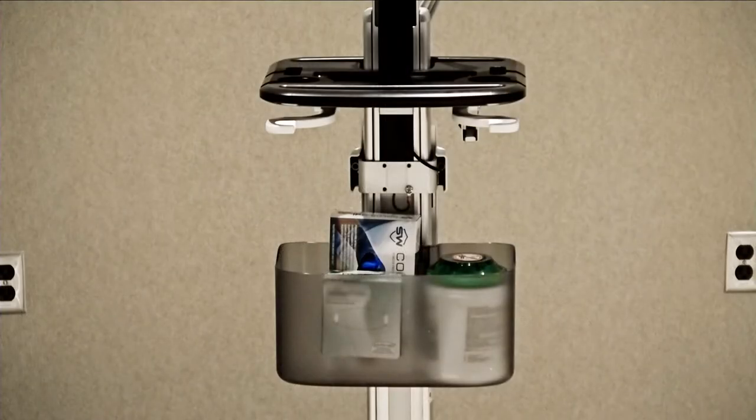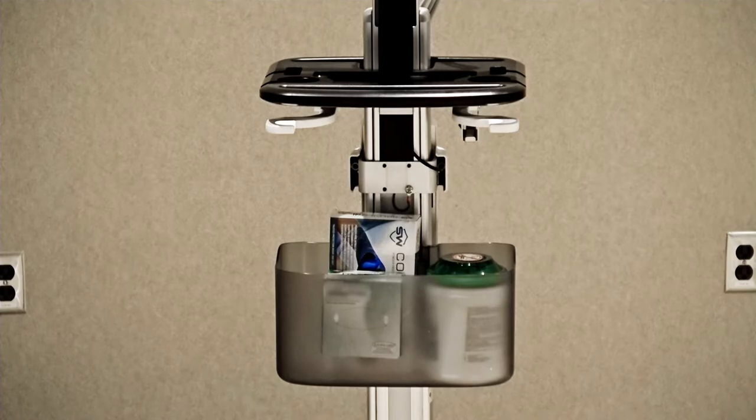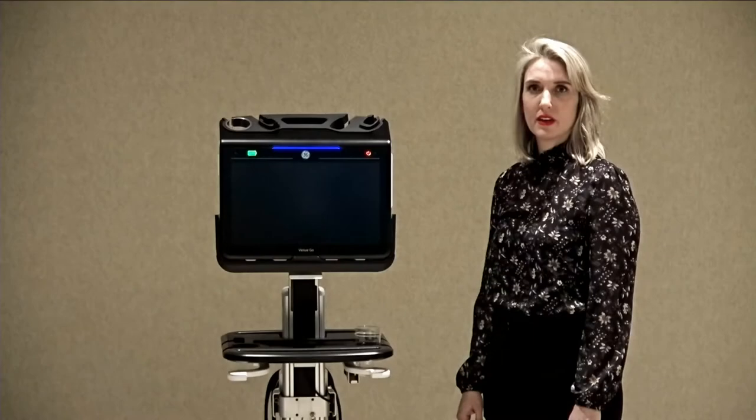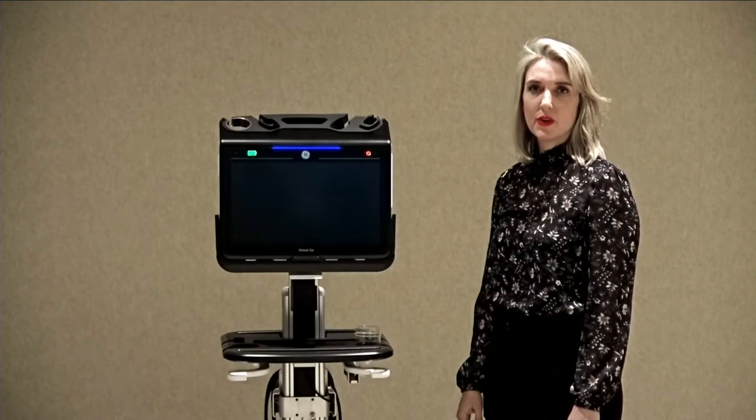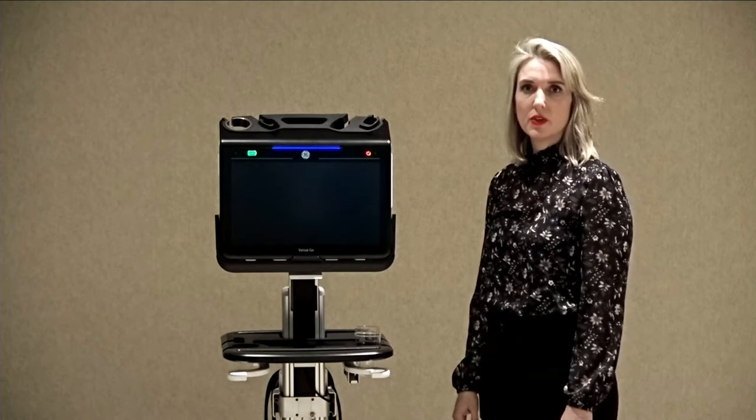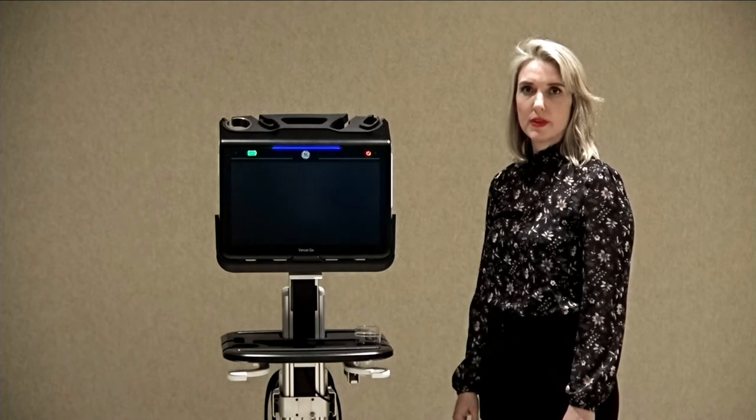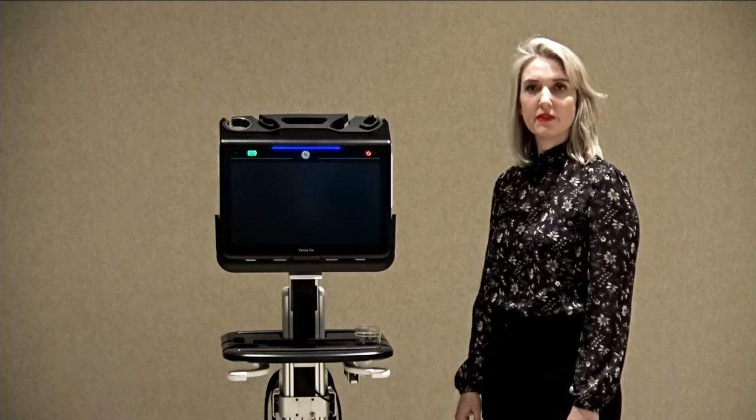The Venue Go comes with a storage bin for your supplies. Additional optional accessories include an ECG module, a black and white printer, and a barcode reader. Both the Venue Go and the Venue Go cart are customizable. You can place the gel cups on the cart and the probe inserts on the system where it's convenient for you.